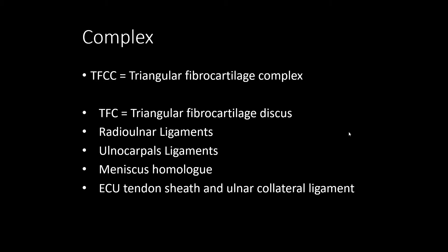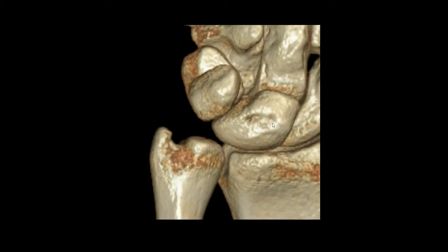The TFCC is the whole complex comprising all the different structures. It includes first of all the TFC — the discus proper — which is the triangular fibrocartilage discus that you can always see on your wrist MRIs. The TFCC also comprises the radio-ulnar ligaments, with a volar and a dorsal one, the ulnar carpal ligament, the meniscus homolog, and also the tendon sheath of the ECU tendon.